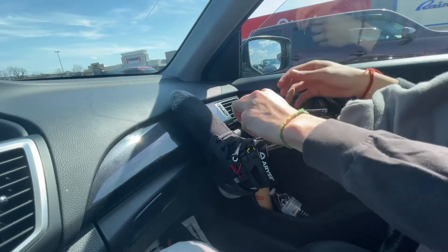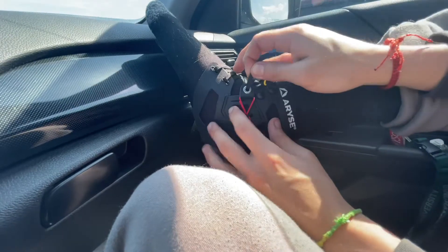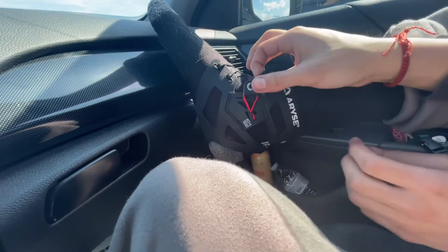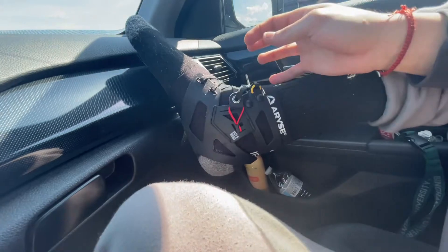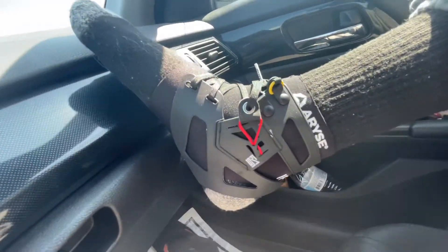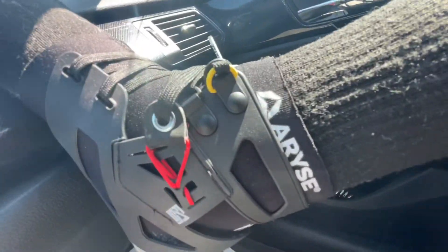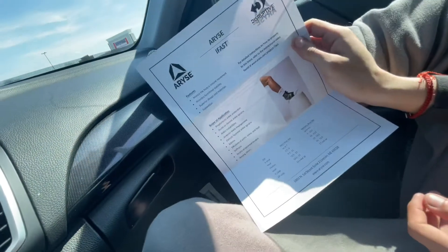Wait — this is what I saw online. This apparently adjusts to your ankle compression or something. I don't know, I gotta look at the instructions. Well, the instructions don't show much.